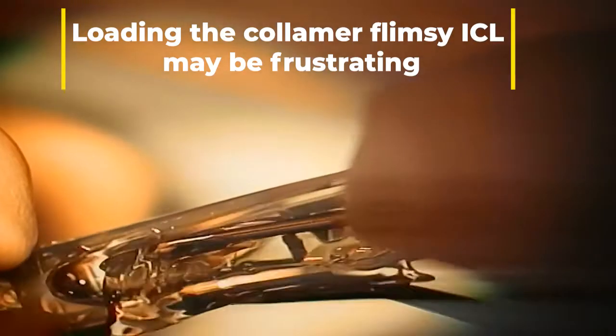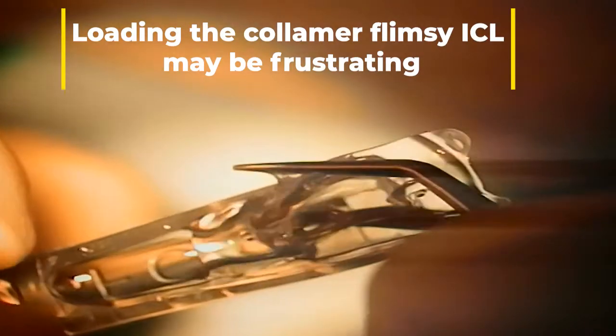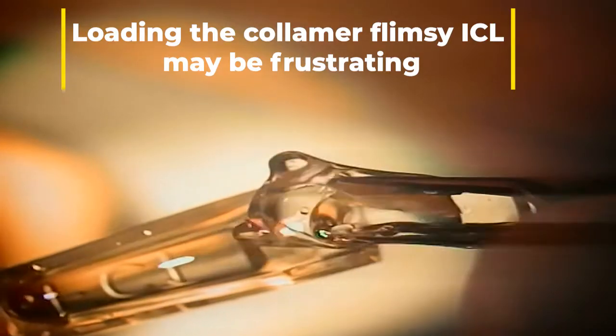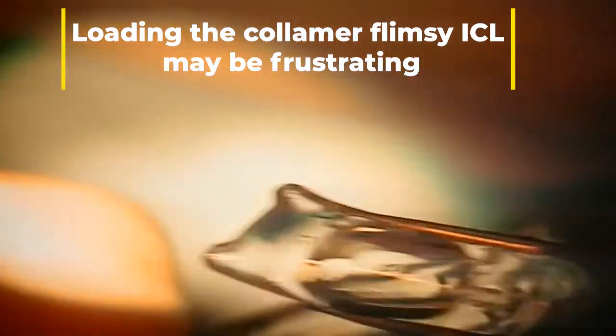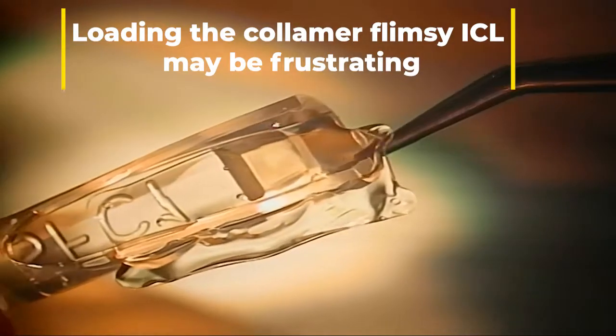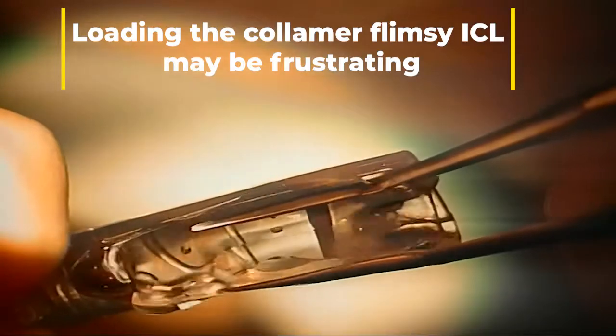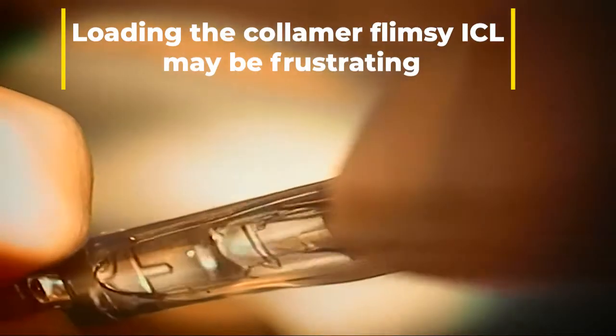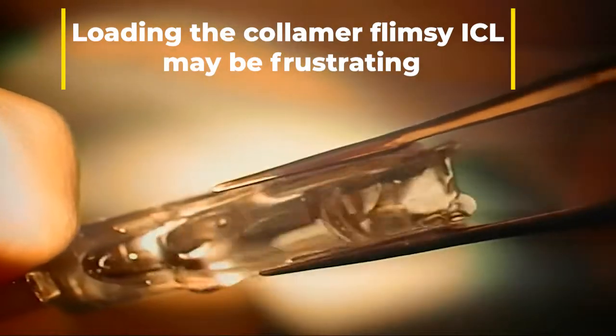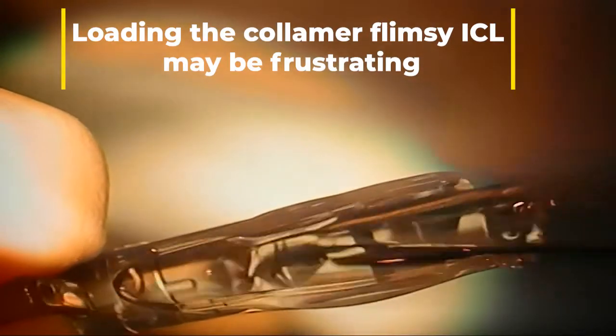The lens is very thin, very flimsy and tends to fall out, to stick to the forceps when we pull the forceps back, or to fold around itself in the wrong direction. It is really sometimes frustrating to spend so many long seconds just to put the lens inside.